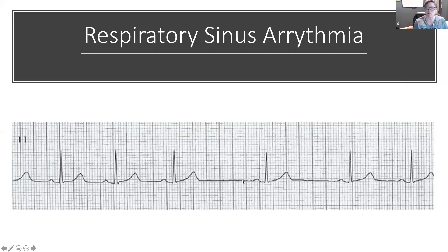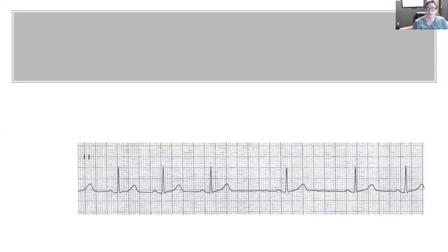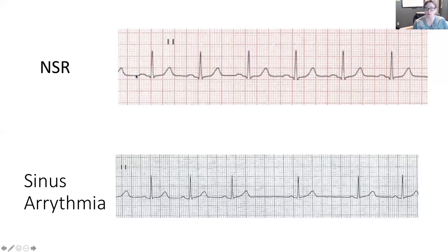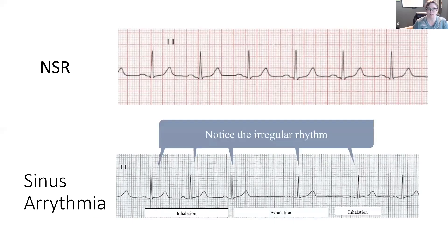That gap could be several things, which is why we do our analysis. Comparing to a normal sinus rhythm on top — carrying along like clockwork — versus the sinus arrhythmia below, which speeds up, then slows, then speeds up again. Notice the irregular rhythm: this is the hallmark of a respiratory sinus arrhythmia. All other parameters will be normal except for that irregular rhythm. You'll see inhalation correlates with increased heart rate and exhalation with decreased heart rate; measured R-to-R intervals within each phase will be very similar or the same.